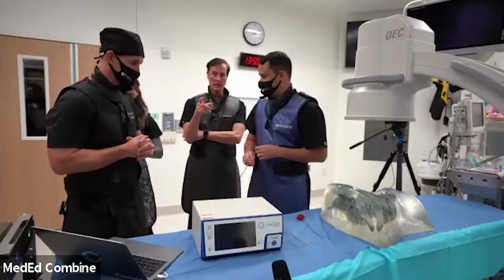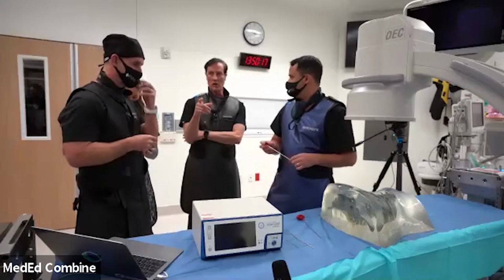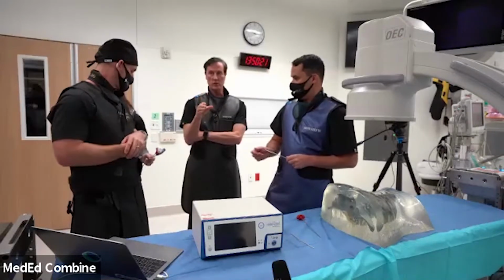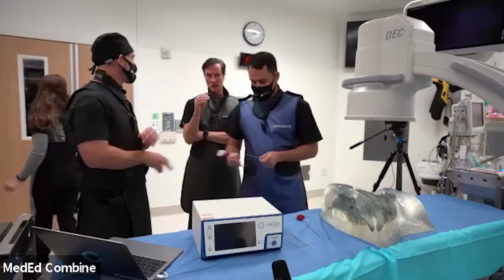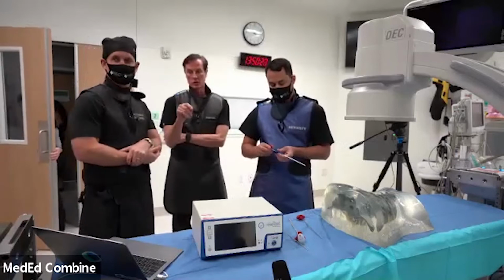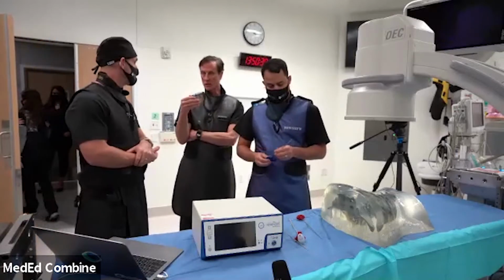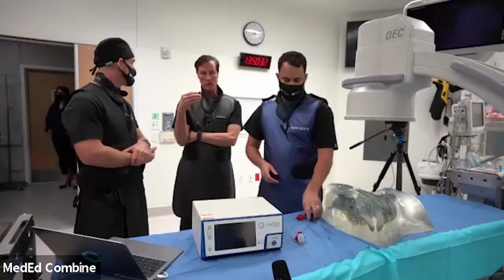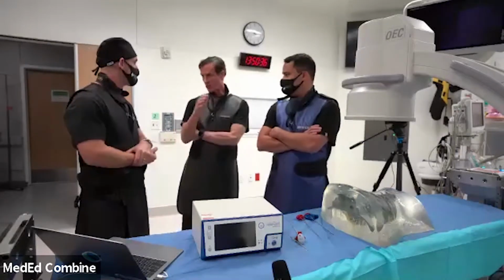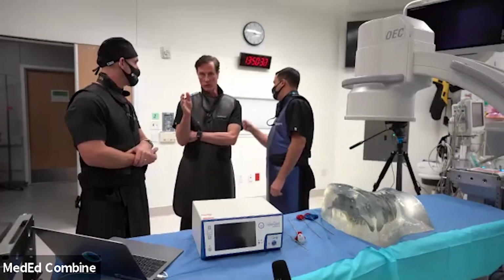So one of the things that Anthony said previously about being spot on, I want to emphasize. In the SMART trial, the single greatest predictor of outcomes and success was the ability to target that basivertebral nerve. Yep. So if you look back at the case failures, and we always want to make ourselves better, the case failures overwhelmingly had mal-targeting of the nerve. Yeah. The nerve was just missed.